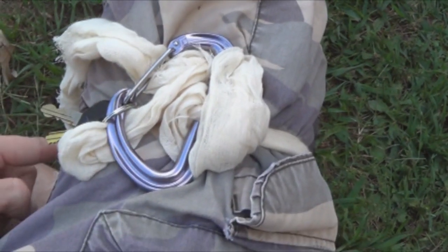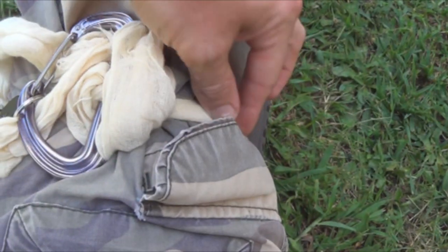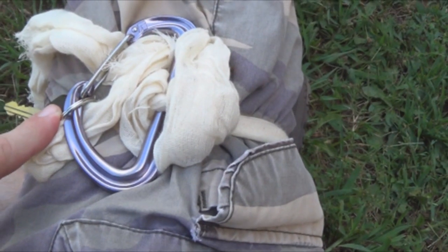Here is a closer look. You can see the tourniquet is wrapping around — you would want this as wide as you can get it, it is kind of narrow here. This spins around, this is making the pressure, and then it locks into place.